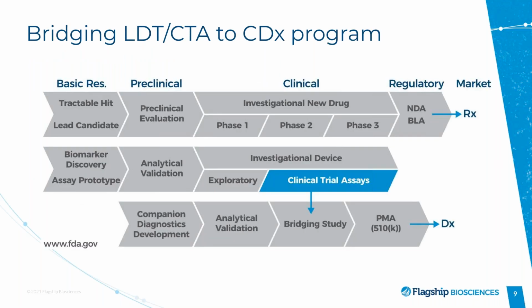Great. All right. So talking about bridging your lab-developed test to a clinical trial assay, Mike and Susanna, I think this is a good place for you guys to jump in as well. Yeah, I can definitely comment on this and talk a little bit more about our own experience too. So as I said earlier, we've currently developed a laboratory developed test, and that is actually being run by Flagship Biosciences currently to prospectively screen patients that have high tumoral expression of the target of our drug for our phase 2 trial. Of course, at this time we are, like I said, planning for success.